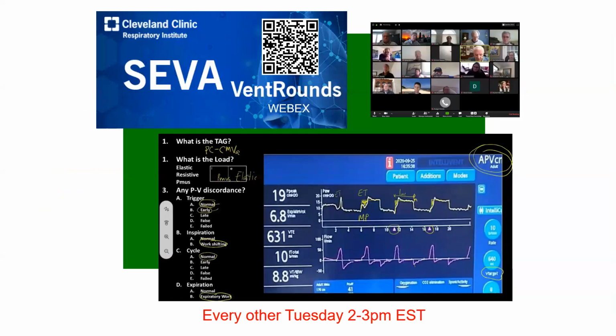Okay, I want to point out some other resources for you in learning how to do this. Every other Tuesday from 2 to 3 p.m. Eastern time, we conduct what we call Vent Rounds. Vent Rounds is a live online presentation of ventilator waveforms, real ventilator waveforms from real patients. We annotate them. We take you through the 4-step process to define what's going on and what you're going to do about it. And it's just a lot of fun, and you can submit your own waveforms if you want. So I recommend that you join us for that.